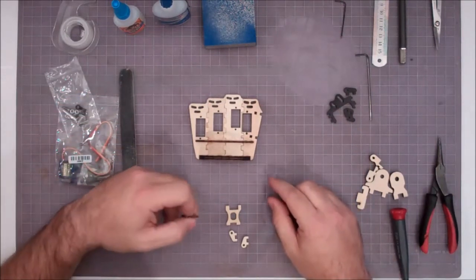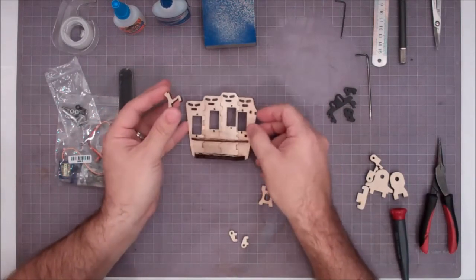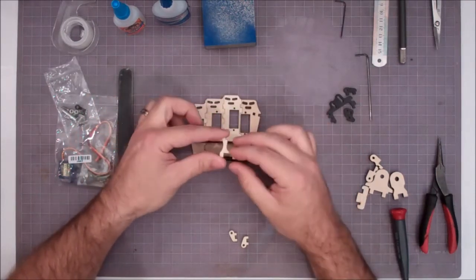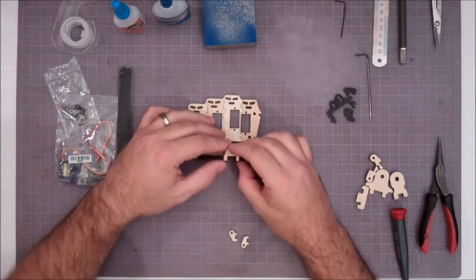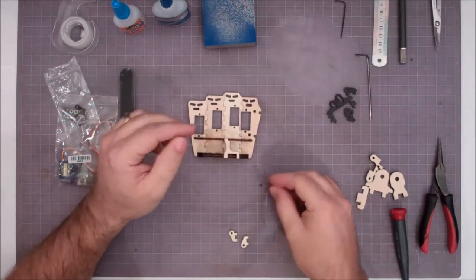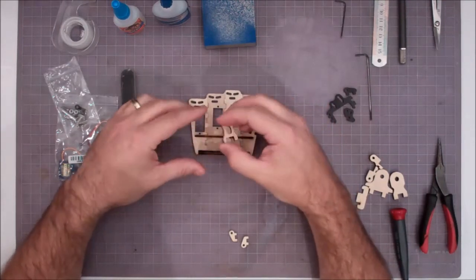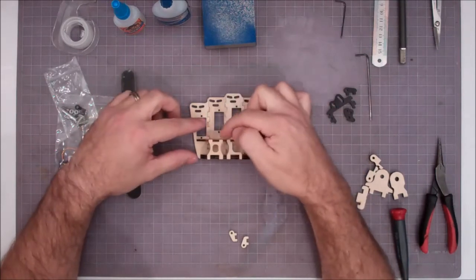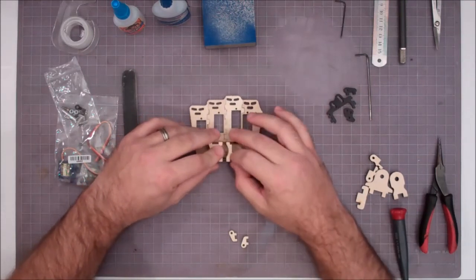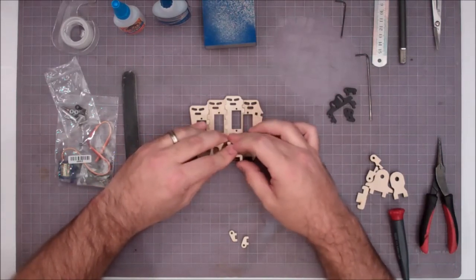Now what we have is these little braces. The brace that looks like an L fits over here. I've flipped this part over so you can see the notches represent the thumb, so always remember the thumb side. So this L goes on here pointing towards the thumb. And if you just lay it on here, you'll see it's got its own little place to key into there. And it'll fall right into position. Again, a notch for the thing. And then we've got the other plate. Now this plate's a little tougher. You got to set it on there and flip it a couple times and find the way that it fits. It's wider on the bottom than it is on the top, but just flip it around until you find the place where it wants to just drop right in. All right. And those plates drop right in. Okay.